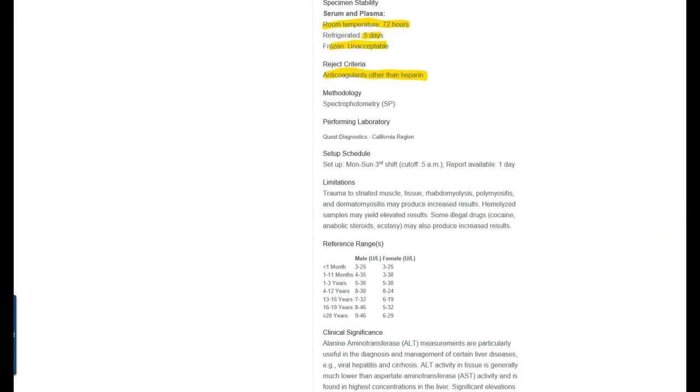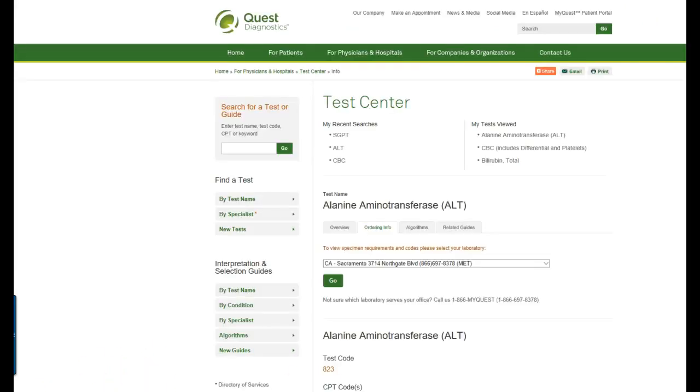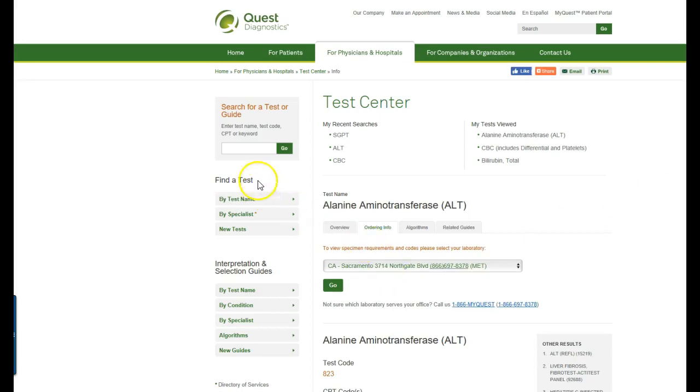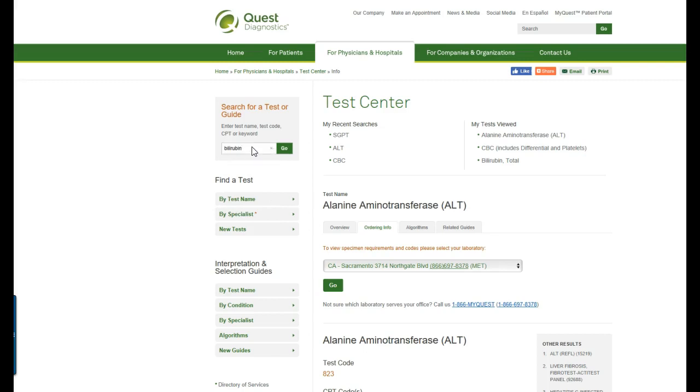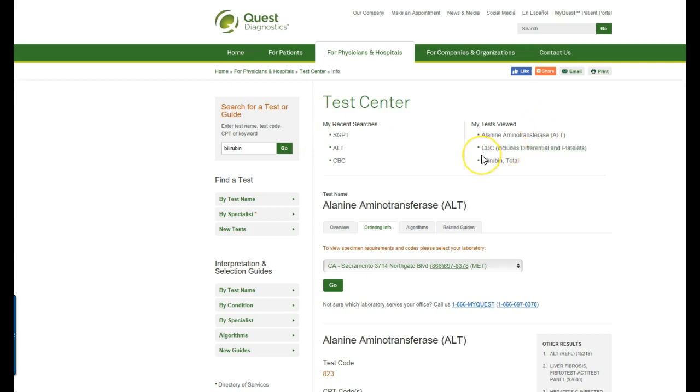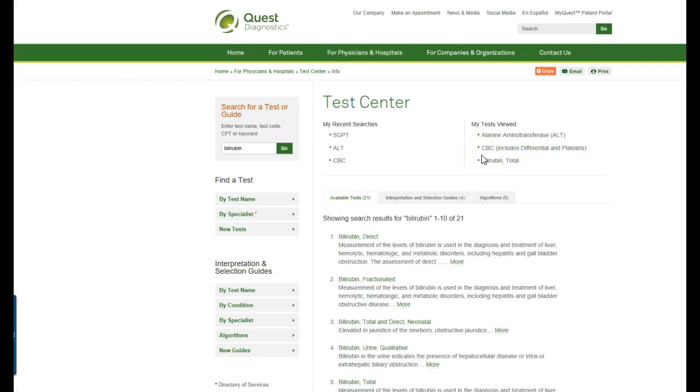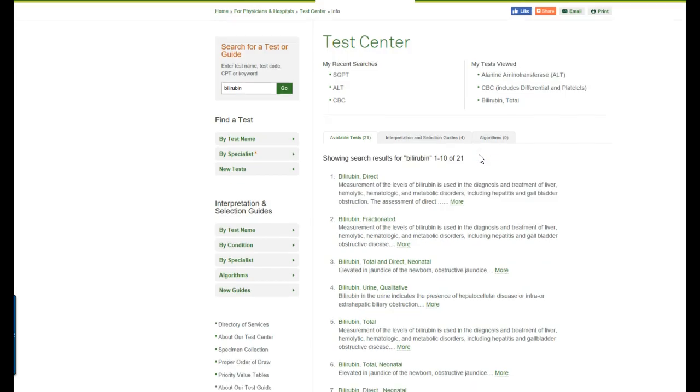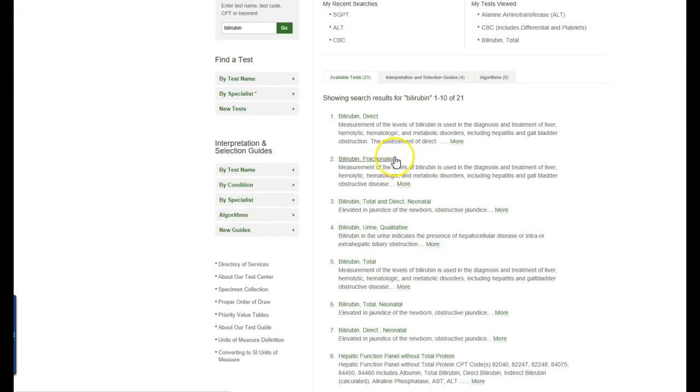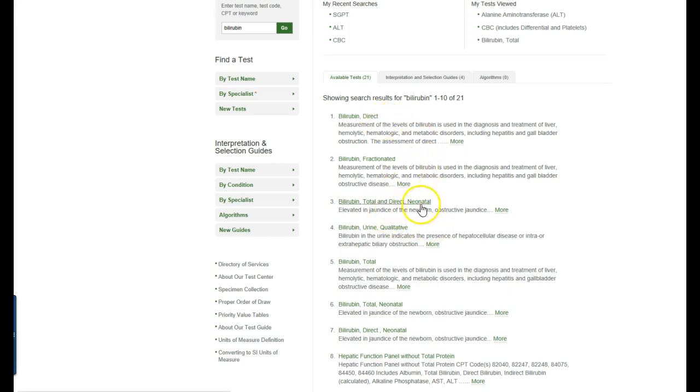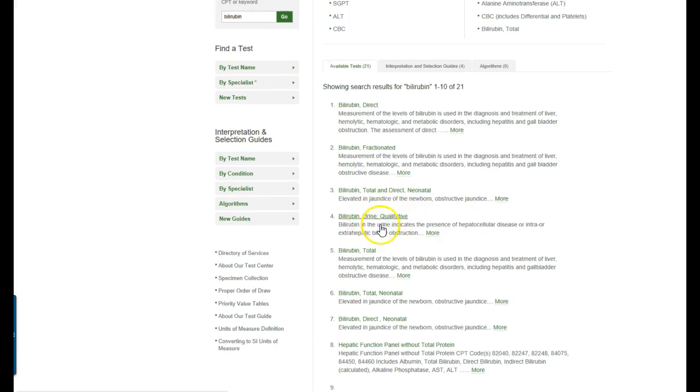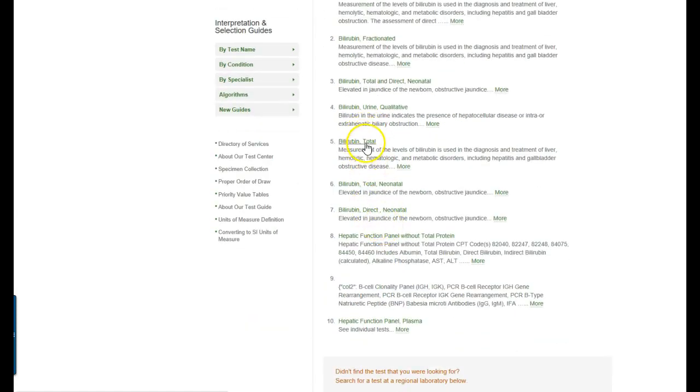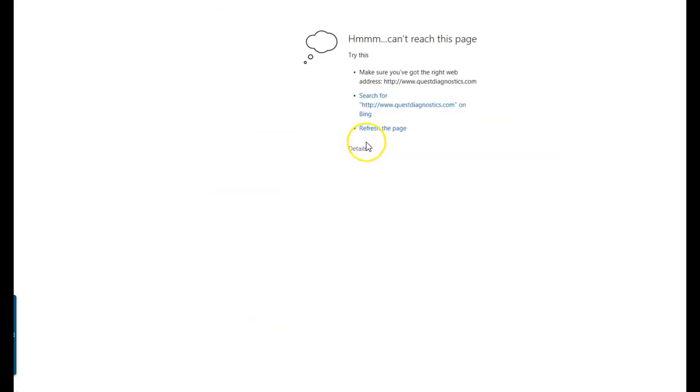So let me get out of this really quickly. And we'll look up one more and I'll show you information. Bilirubin. So I want to look up total bilirubin. So there is a number of bilirubin tests you can order. There's direct bilirubin, a fractionated bilirubin, a total and direct neonatal bilirubin. There's a urine bilirubin. We want to look up total bilirubin.